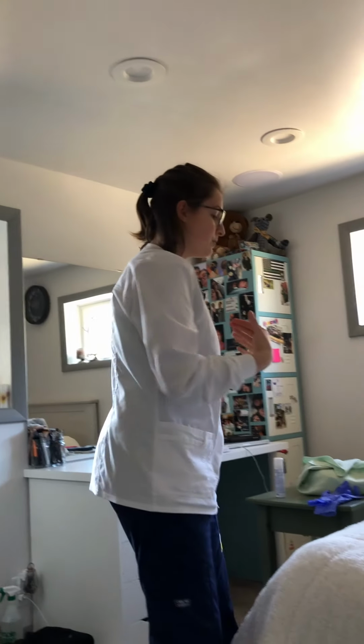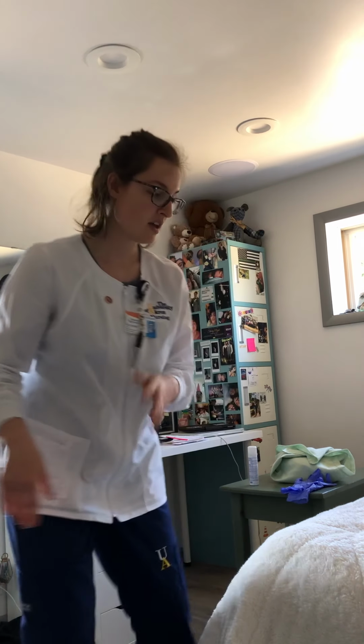So after the patient's all positioned and ready to go, I would have gone ahead and raised up the bed before I put her in dorsal recumbent. I just didn't state that. So anyways, to elbow height for us nurses, just so it's easier for us to work with the patient. We're not straining our backs to do that.